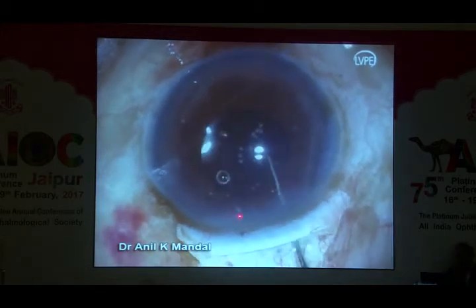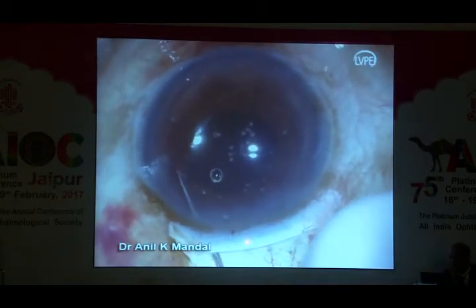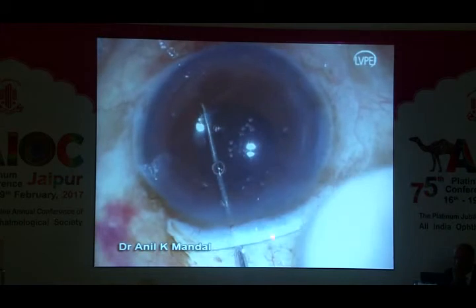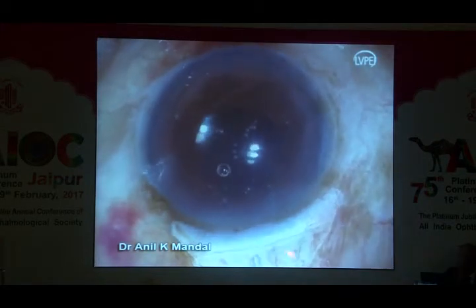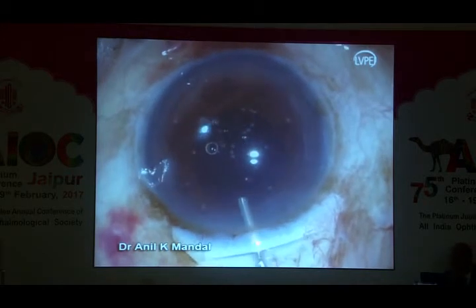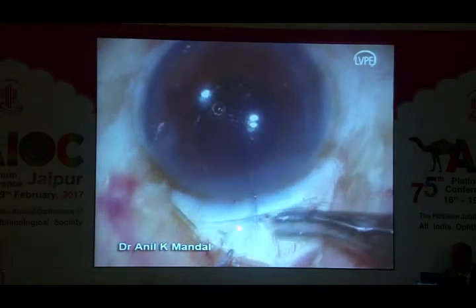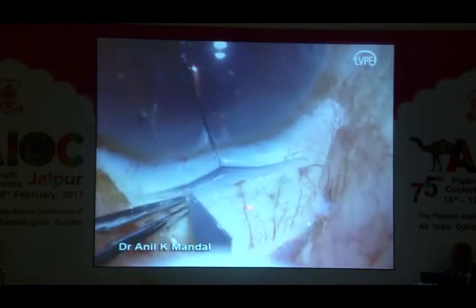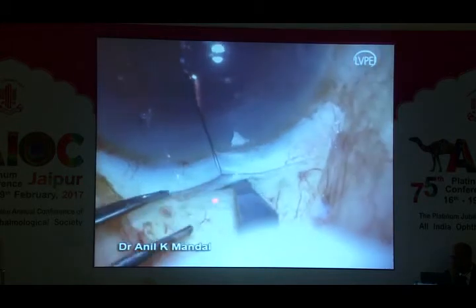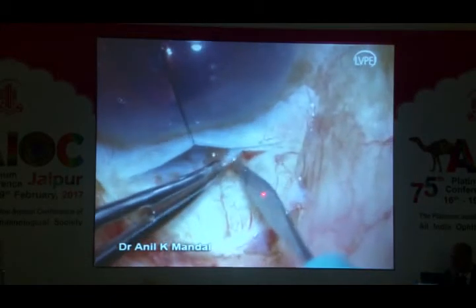It has gone into the capsular bag, and the next few minutes of video will show how the trabeculectomy part of the surgery will be added, and closure of the incision by two interrupted sutures. Before the trabeculectomy part is done, the pressure inside the globe should be reasonable, otherwise there will be difficulty in removing the deeper block to complete the trabeculectomy. Hold here posteriorly, give a straight incision, and then do the trabeculectomy as it is done in the standard way.